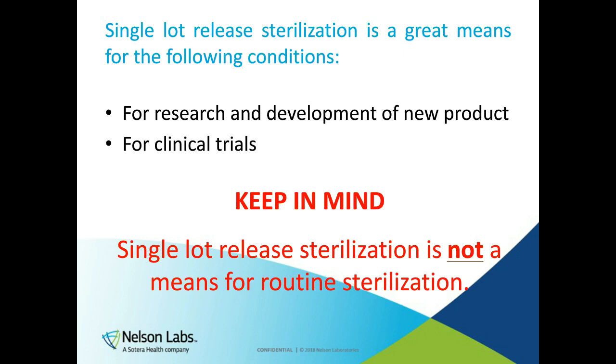Single lot releases are a good means to perform research and development of new product if you need a claim of sterility on those devices. And it's also good to have a claim of sterility for clinical units that you will be using for clinical trials. So if a product meets these conditions, then it's a good means of sterilizing product and actually having a sterility claim. Must emphasize that single lot release is not a means for routine sterilization and should be only for clinical trials or for research and development as well.